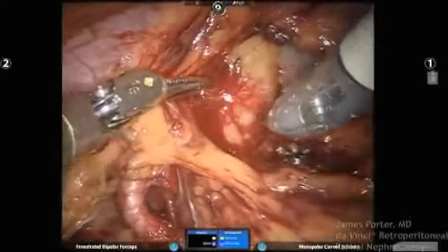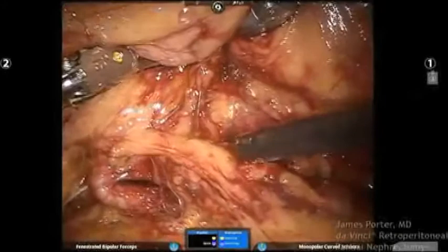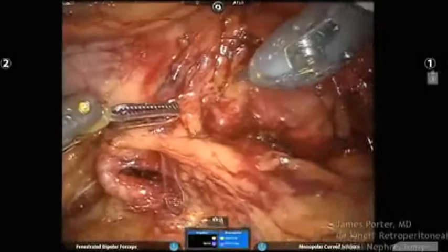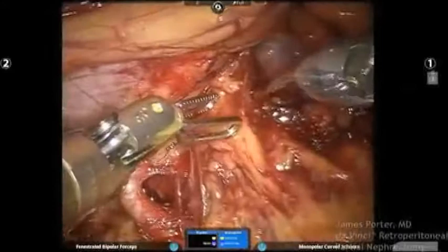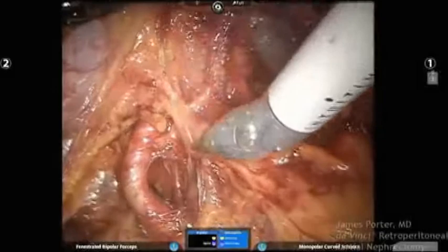Check right here, please. How about the panel? Ben or Mike, Lee, do you guys have a preference? I tend to clamp the artery and vein. I want to do everything possible for a bloodless field. Right there, Nance. And so it's been my practice to always clamp both. So I agree with Jim, and then I'll typically put two bulldog clamps on the artery in order to get good opposition. And I will generally clamp the vein as well.